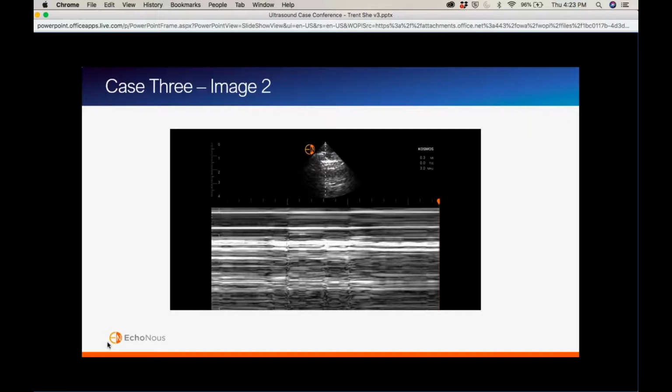What happens is, if there's no motion in your lung field with M mode, the image that M mode acquires pretty much looks exactly the same on the top and bottom. Based on other movements, it almost looks like there's a barcode coming down. If you see in the middle there, you can see these lines that cross the entirety of the image.